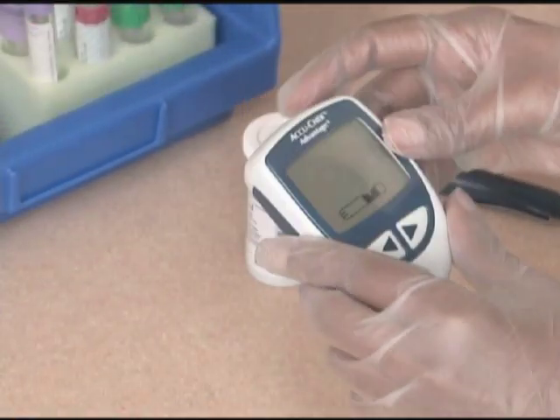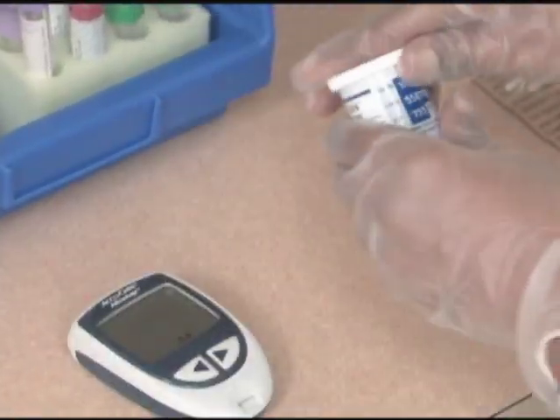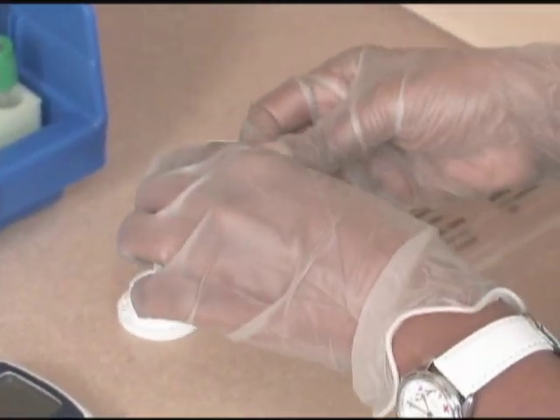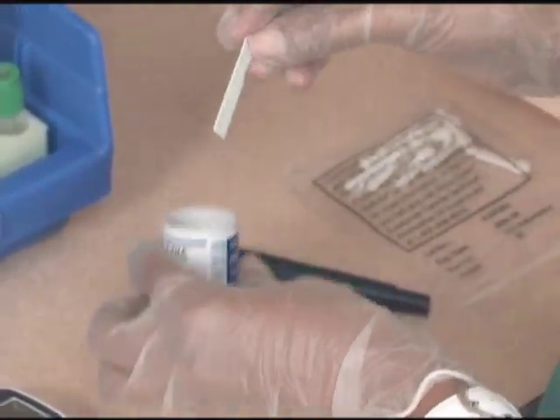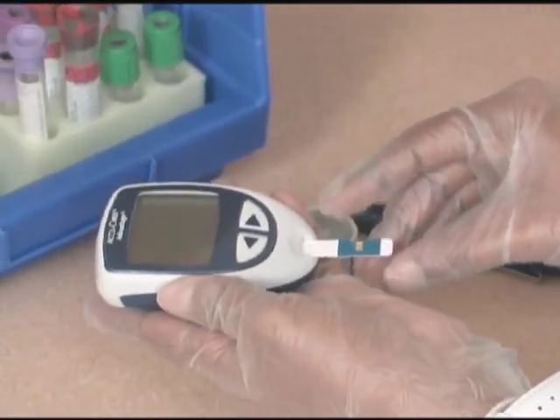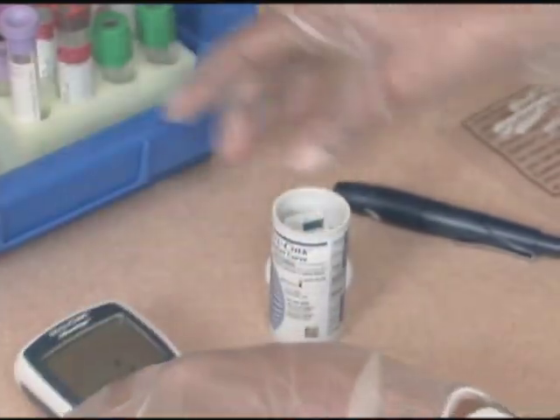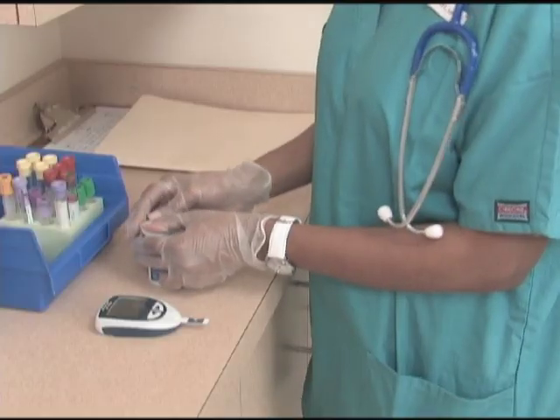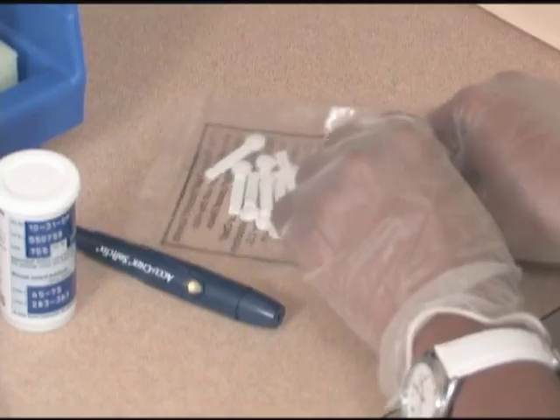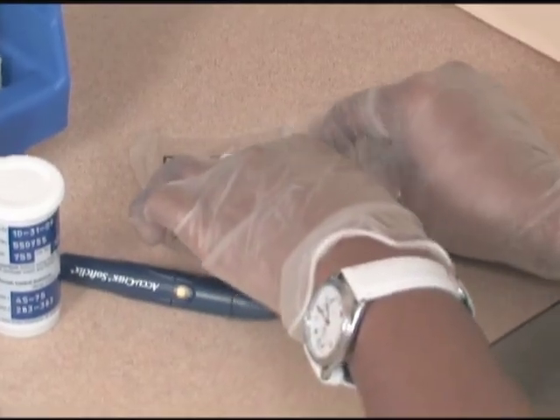Wait for the meter to indicate that it is ready for a test strip. Within the short time frame specified by the glucometer model, insert one test strip as directed into the meter.